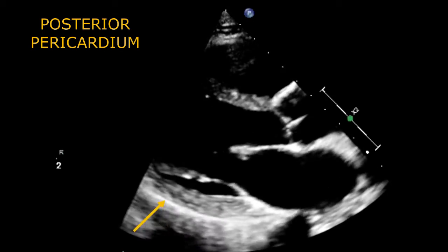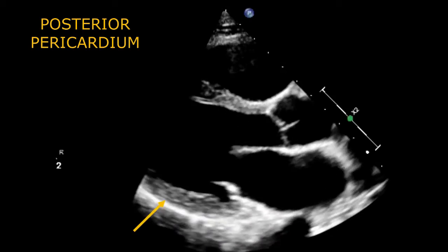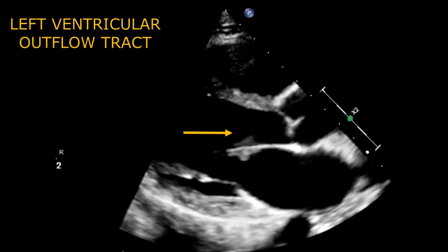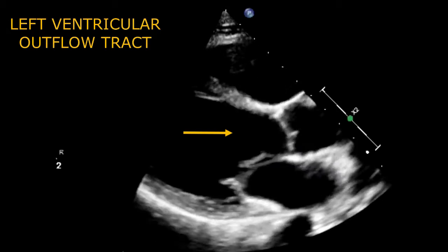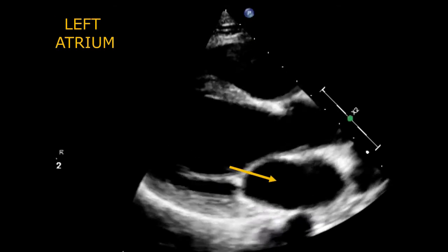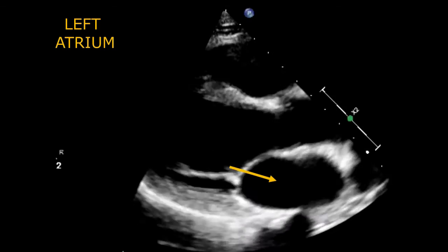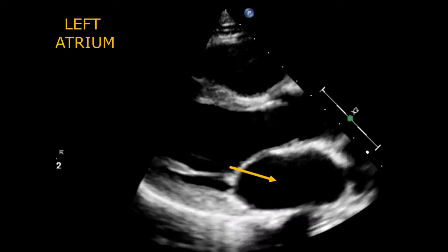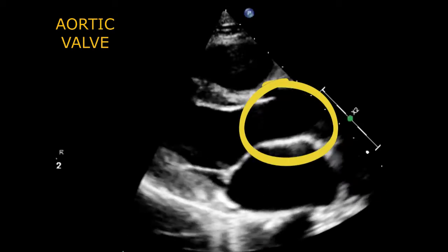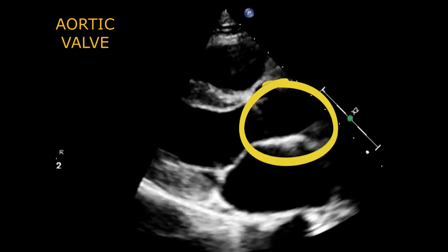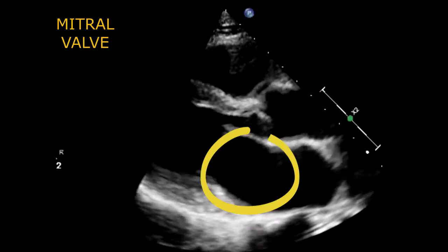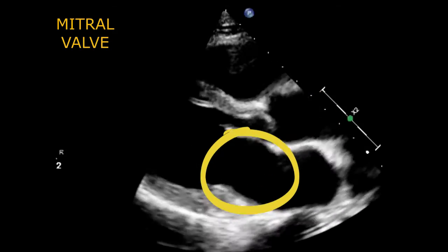Posterior pericardium. Left ventricular outflow tract. Left atrium. Aortic valve. Mitral valve.